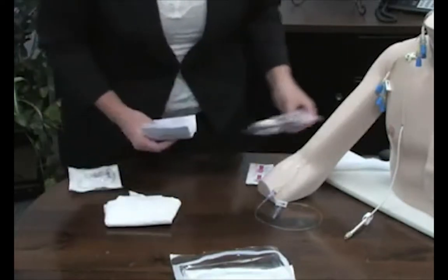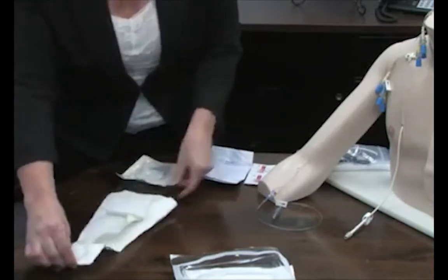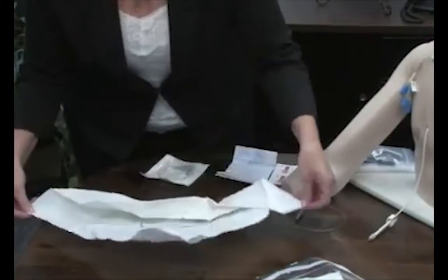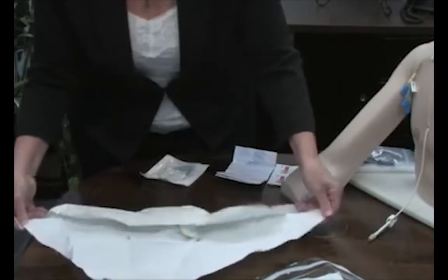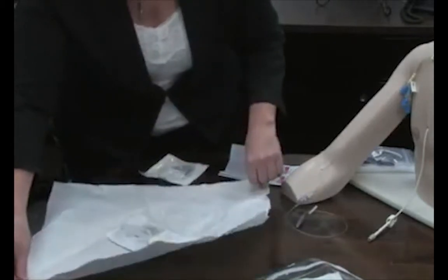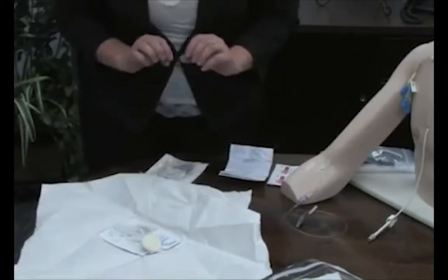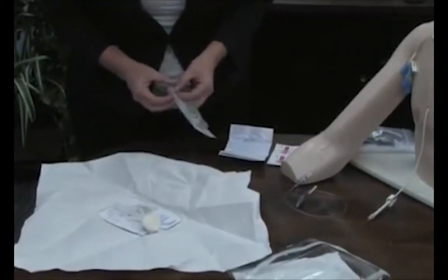Whenever you're opening up your sterile field, it's important that the like 1-inch area around the edges is what you consider non-sterile. So as you pull it apart, you want to be real careful not to pop it or anything so there aren't any supplies that might launch out at you, and to only touch the edges. When you do that, you're able to consider the entire inner area as sterile.